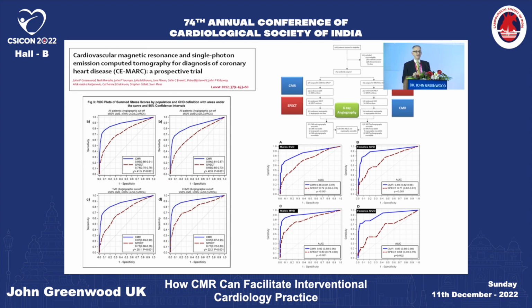So even if the 2 tests non-invasively were normal, we still went and did the angiogram, because this is the only study that has actually truly demonstrated the false negative rate of diagnostic imaging. And false negative is really important, and it drives the sensitivity. And so what we see in the imaging literature generally is a sort of inflated view of what sensitivity really is, because patients with negative imaging results very rarely get into the cath lab in clinical trials.